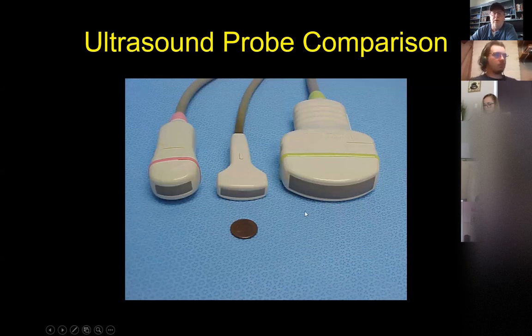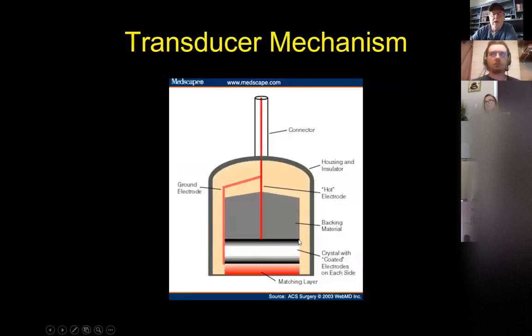When you transport these probes, people will put them in protective devices that go around them. I've seen people use a sock they put around, or they go buy some of that insulation you'd put around a pipe to keep it from freezing, that you would get at Home Depot, and cut it, and you can wrap these in that. Anything to protect them. So it has this little thin window.